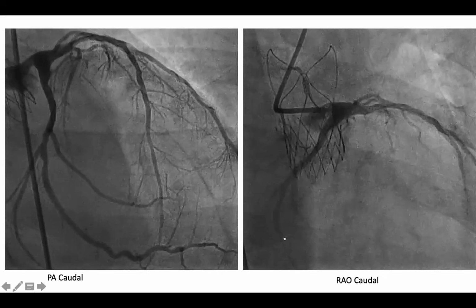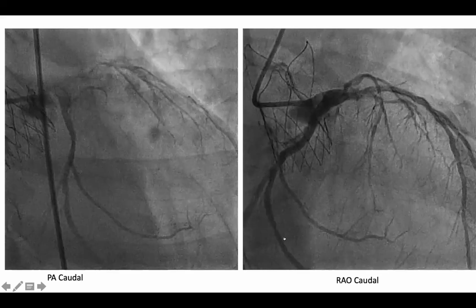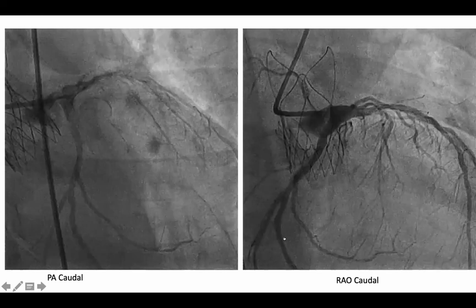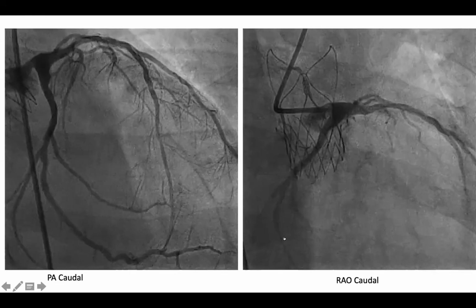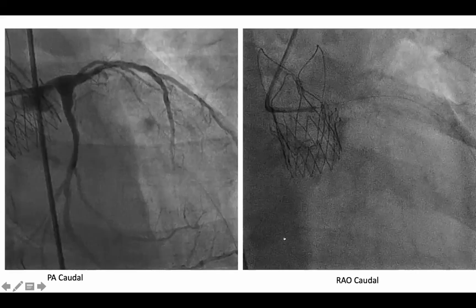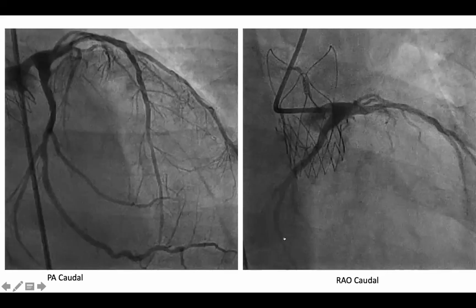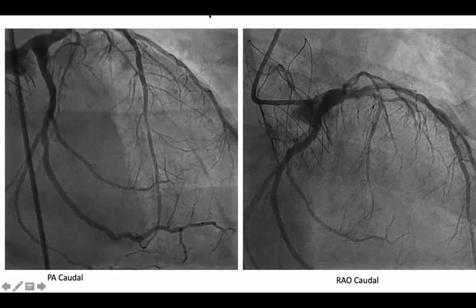70% would like to go radial, but 7 French. Okay, interesting. You can all see what's on the screen? Yes. Okay, it's quite interesting, actually. 7 French radial, although it's better to have 7 French, but it may not always be possible.